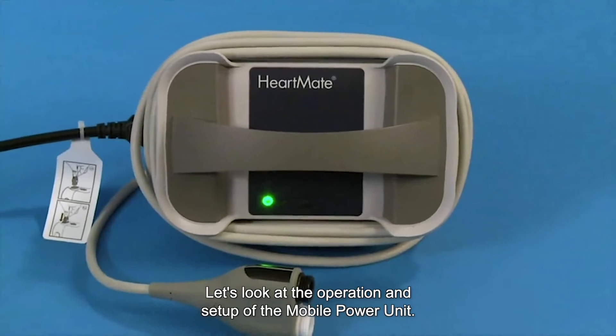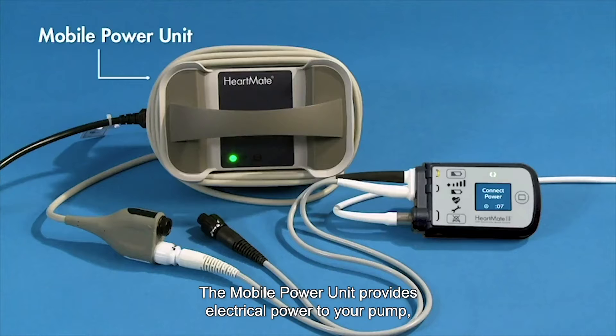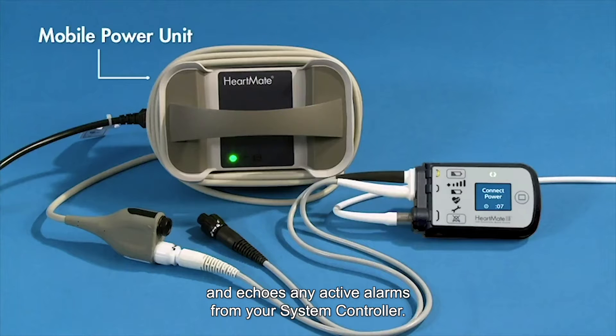Let's look at the operation and setup of the mobile power unit. The mobile power unit provides electrical power to your pump and echoes any active alarms from your system controller.